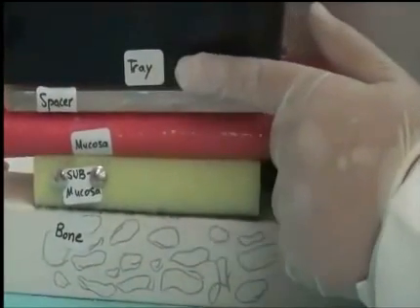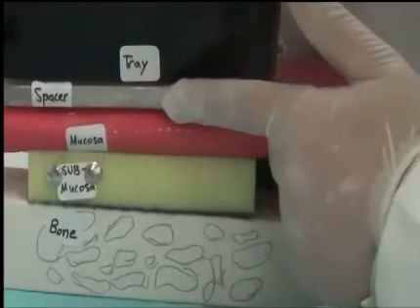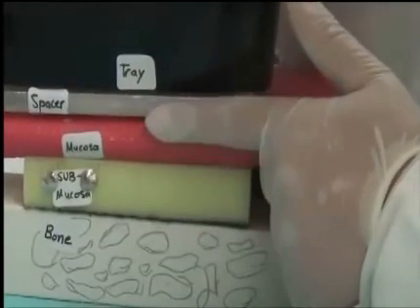What happens in the case of the presence of the spacer? So this is a tray with a wax spacer in, and the mucosa, submucosa, and bone.